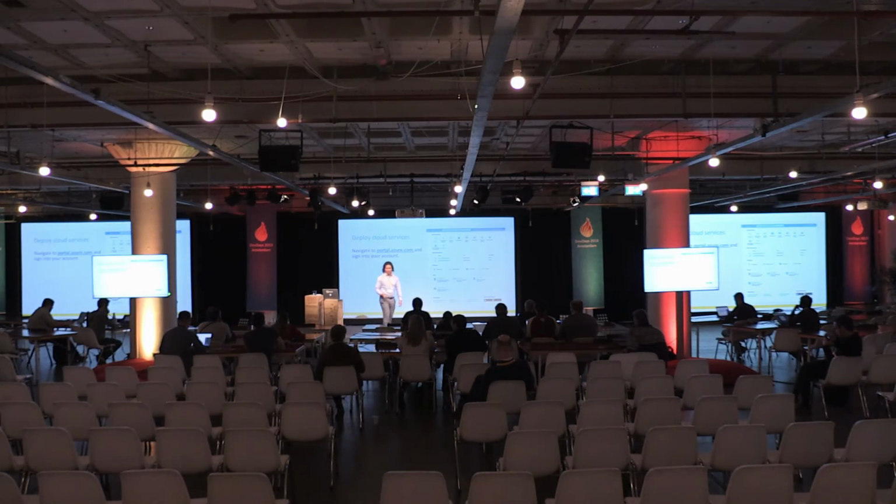Okay. So hopefully you're at portal.azure.com. It should look like the screen on the right here. And then you want to navigate to your Azure Active Directory. So there is an icon here. It looks like a pyramid. Just click on that, and you're going to go to Azure Active Directory.